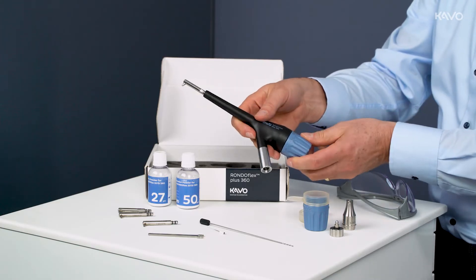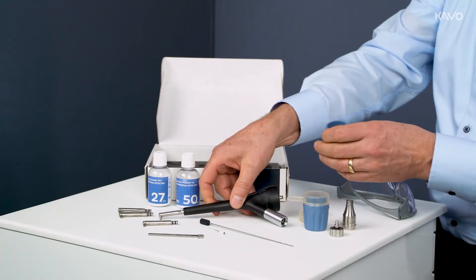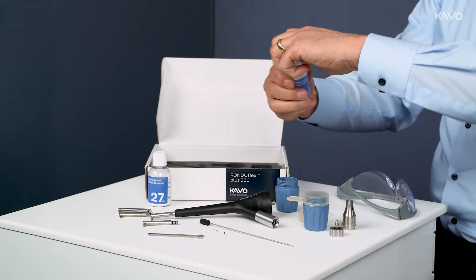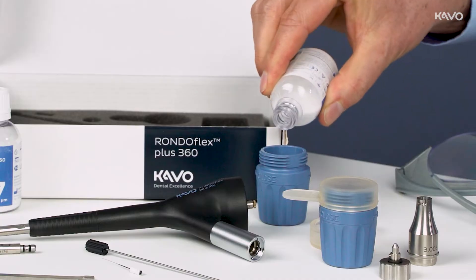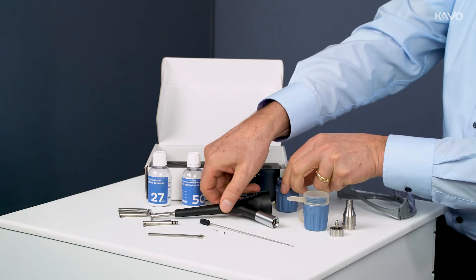Next, unscrew the powder container, fill it with the appropriate powder, and screw it back on. Only fill the powder container to approximately 70% capacity.